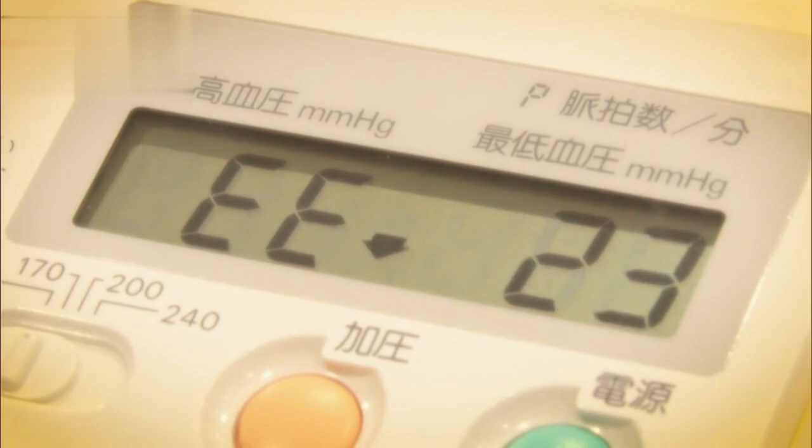Customers that were purchasing a blood pressure monitor for the first time didn't know what setting to pick to match their blood pressure. They weren't certain of their blood pressure in the first place. It would hurt if the cuff squeezed too hard, and if it was too weak, they'd get an error saying to do it again. That was the biggest source of frustration.